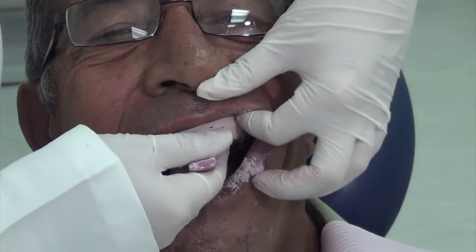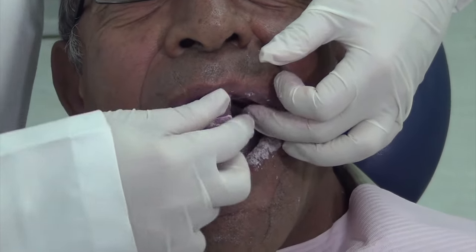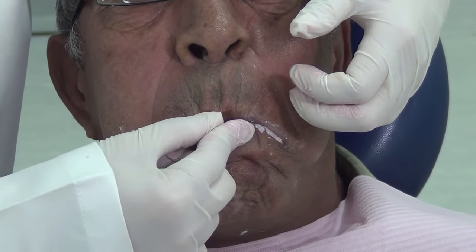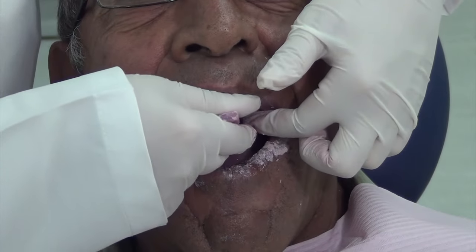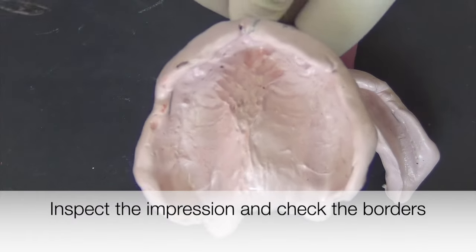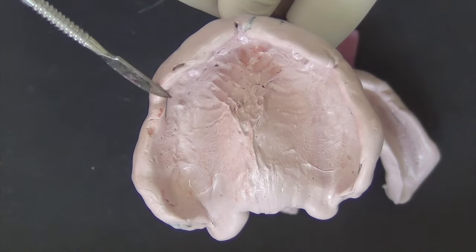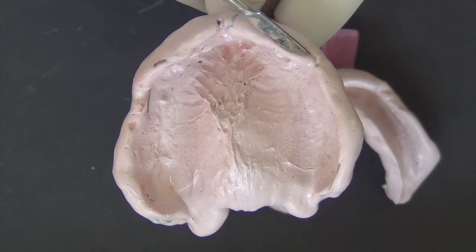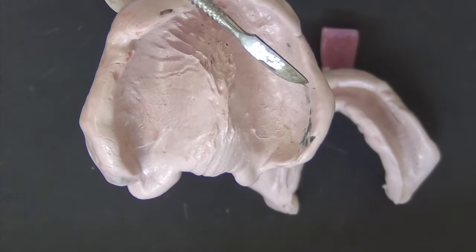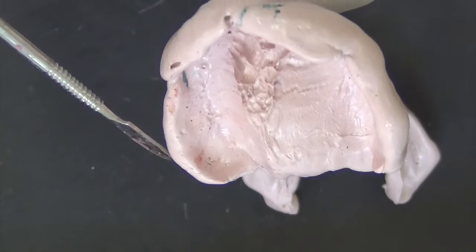If you probe it with your fingernail and it does not leave an indent, the material is fully set. Notice how it can be difficult to break the seal, so ask the patient to seal their lips tightly around the handle and blow forcefully. This will break the seal and allow you to retrieve the tray from the patient's mouth. Inspect the tray under good lighting conditions and make sure all borders of the tissues have been recorded. Once done, disinfect the impression and send it to the lab for the fabrication of record blocks.